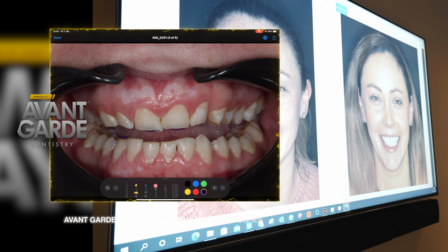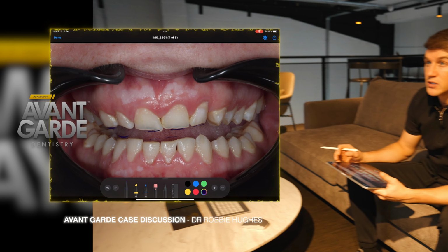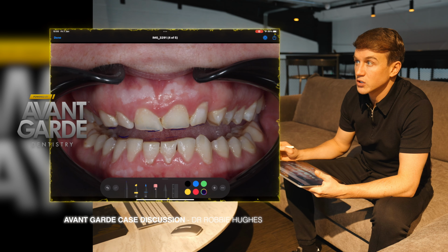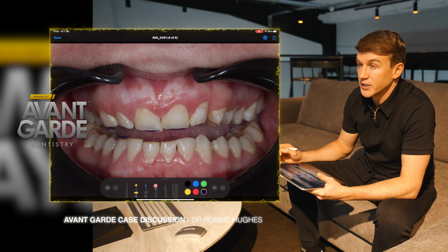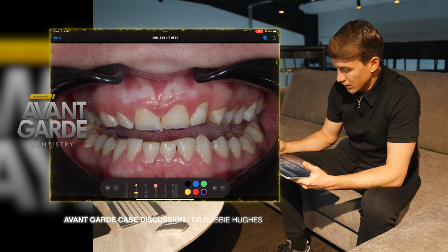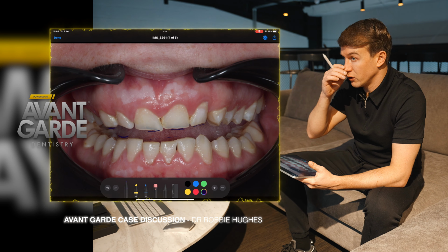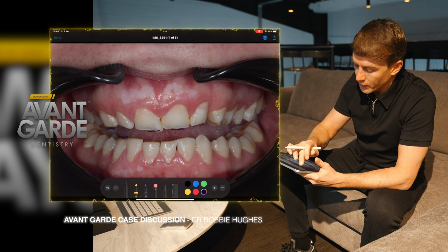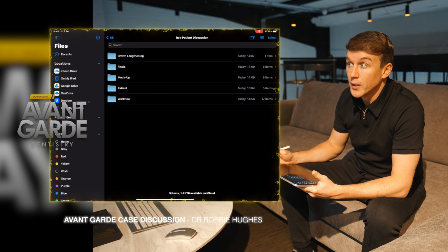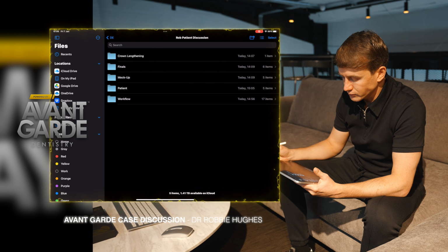We've got to think about the correct tooth shape, size, proportions, the ideal smile design for the patient, how much crown lengthening is going to be needed to achieve that, and how do we reorganize the occlusion so we can reintroduce a predictable function with the correct anterior and canine guidance to prevent any further risk of this wear or fractures of the composite veneers. So we went to the design and we created a mock-up to trial and test in the patient's mouth and make sure that we're going to get all of these things right.